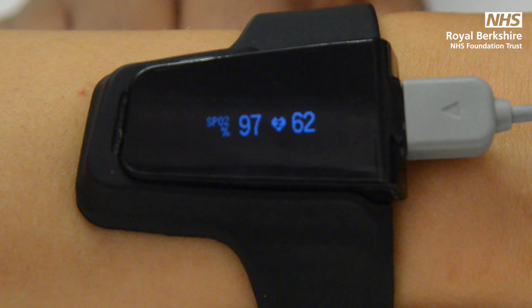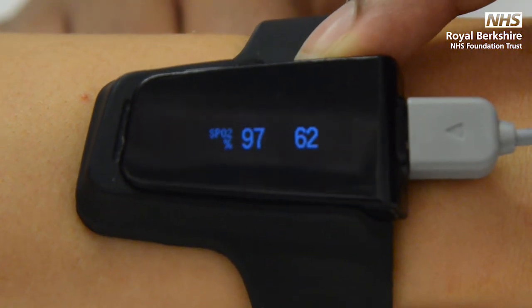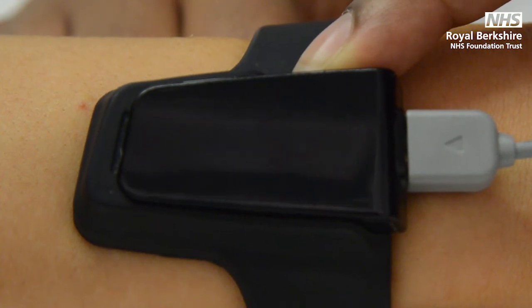Leave the machine running all night, as we need to collect a minimum of four hours of data. In the morning, press and hold the power button to turn the machine off, then place back in the blue case.